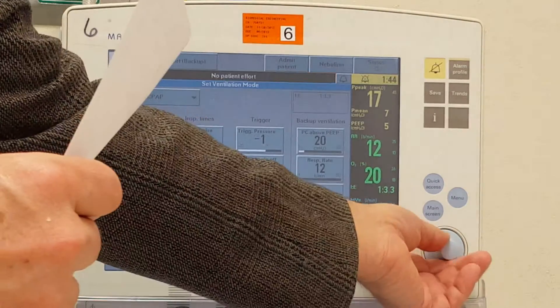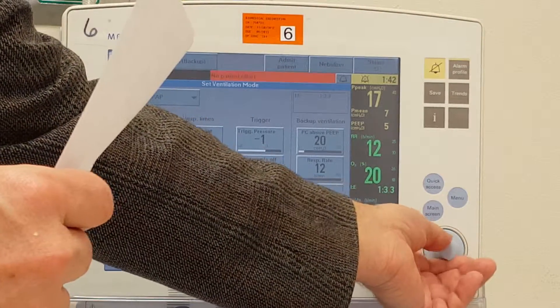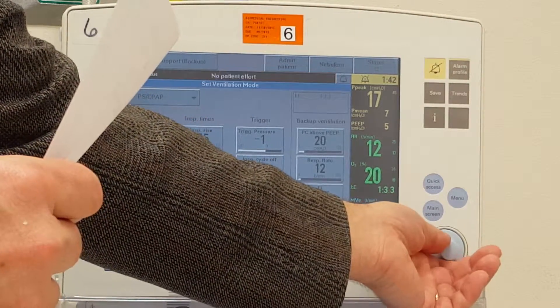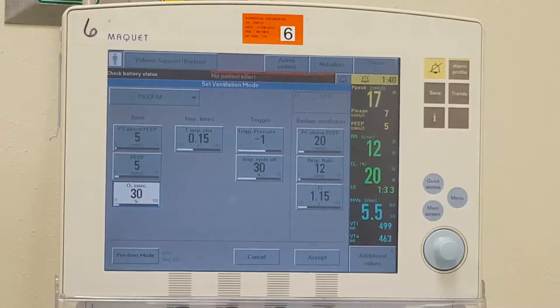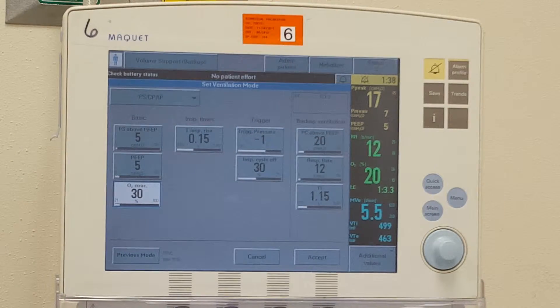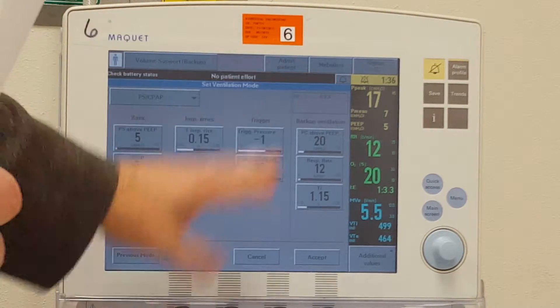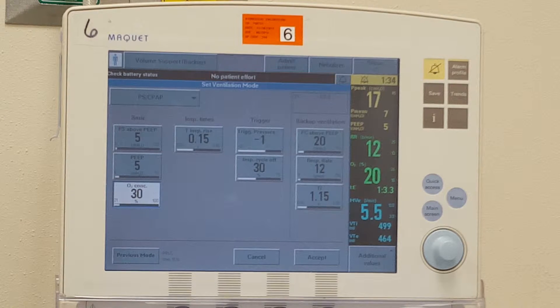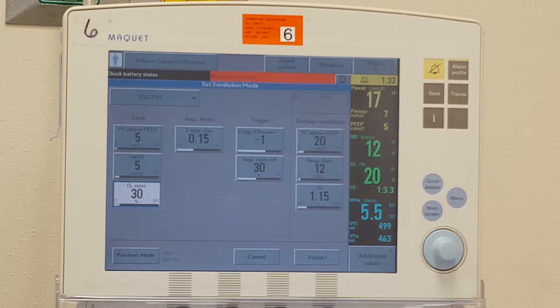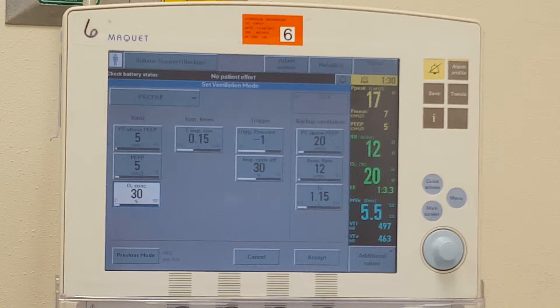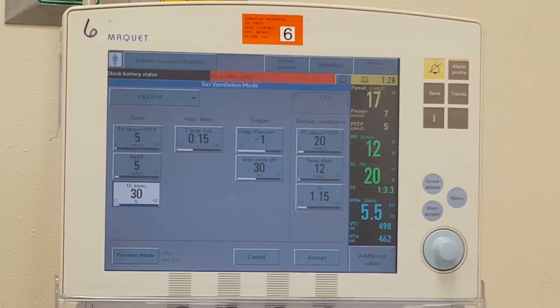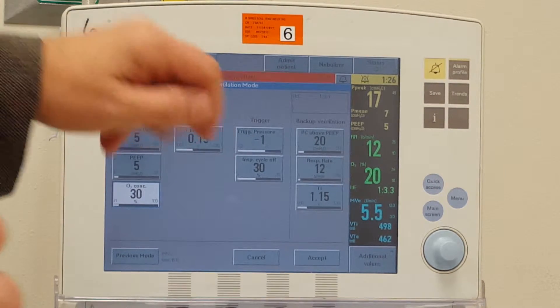Notice most of our patients require oxygen, so on this one we're saying let's put them on 30% oxygen, and then we are going to leave the flow cycle at 30% and adjust all our settings as needed.